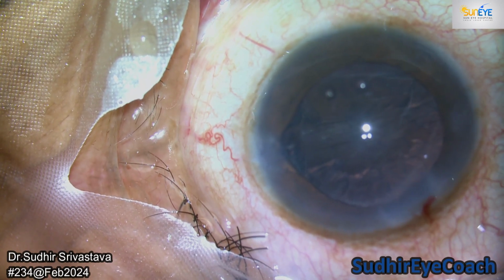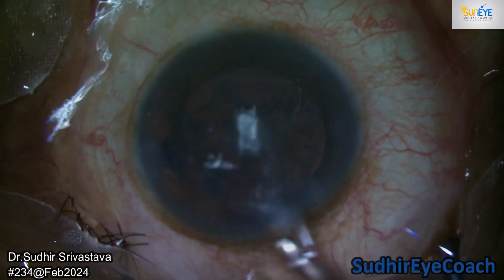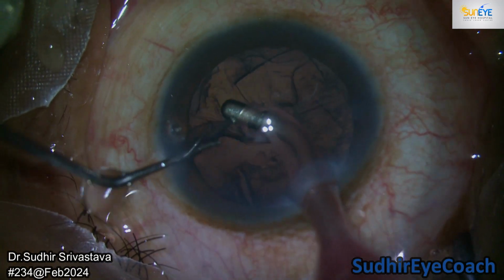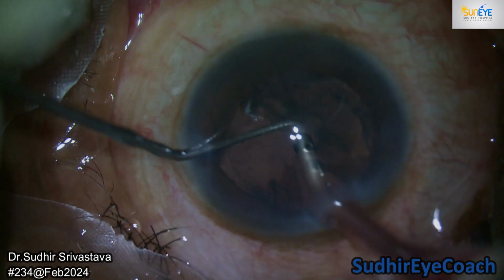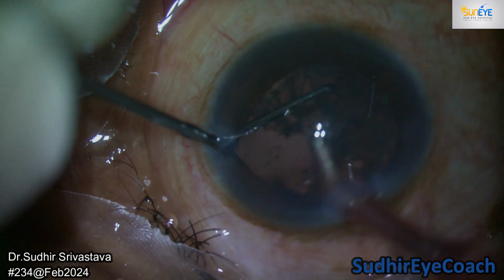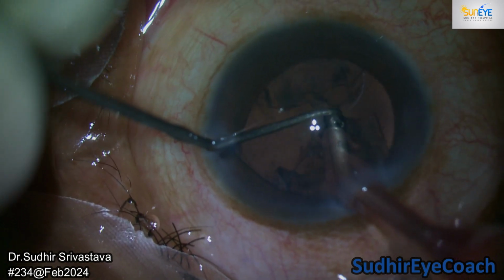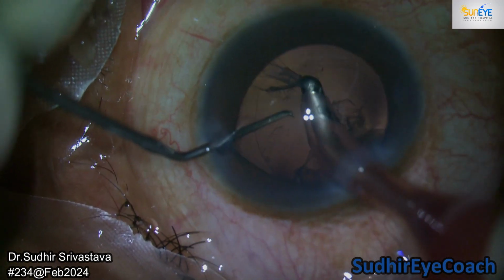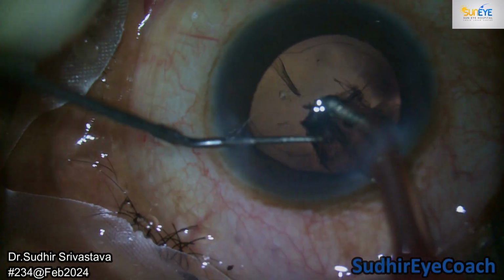Fortunately, I completed the phacoemulsification fragmentation without any problem. There was no vitreous displacement, so I continued with irrigation and aspiration. In cases where we have dialed the endocapsular ring, because of the presence of the ring, sometimes it is difficult to aspirate the epinuclear plate. So you can divide it into upper and lower zones, and then you can easily aspirate it.